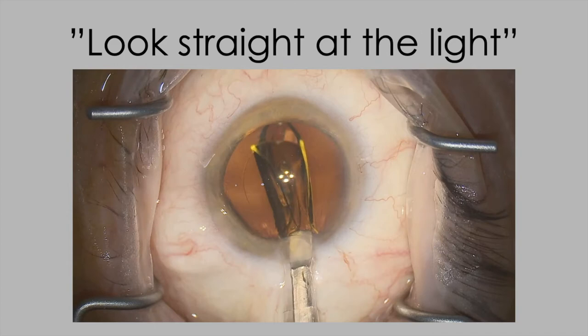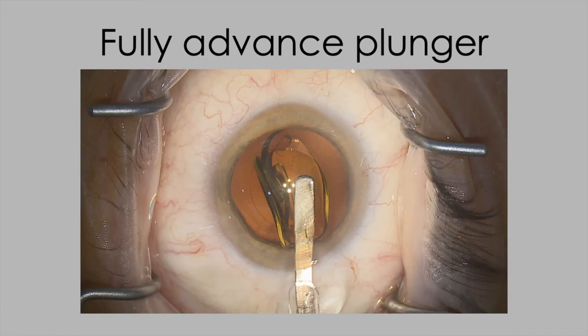As soon as you've got the lens unfolding in the eye, ask the patient to look straight at the light again so the eye isn't moving towards you as you disengage the injector. Then fully advance the plunger over the optic of the lens to use it as a manipulator — this quickly controls the lens to stop it behaving in an uncontrolled way as it unfolds in the anterior chamber.